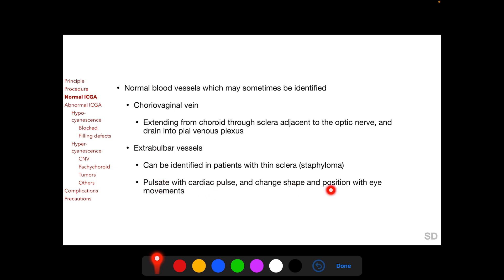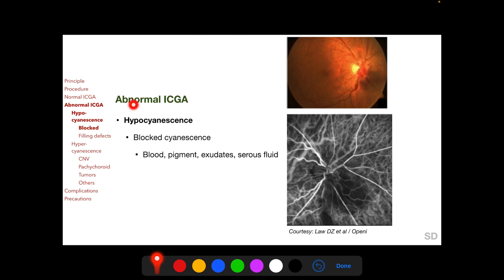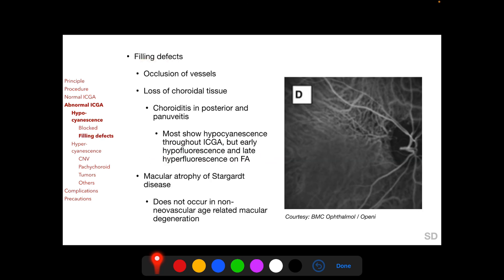Extra-bulbar vessels can be distinguished from choroidal vessels because they pulsate with the cardiac pulse and change shape and position with eye movements. Abnormal ICGA can be hypocyanescent or hypercyanescent. Hypocyanescence can be due to blocked cyanescence from overlying blood, as seen here in this angiogram corresponding to subretinal hemorrhage, or from pigments, exudates, and serous fluid. This is in contrast to blocked fluorescence in fluorescein angiography, where blockage of underlying fluorescence is more complete, because near-infrared wavelengths used in ICGA penetrate blood and other structures more efficiently.